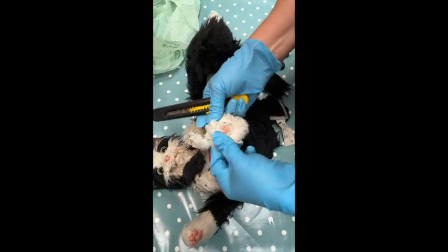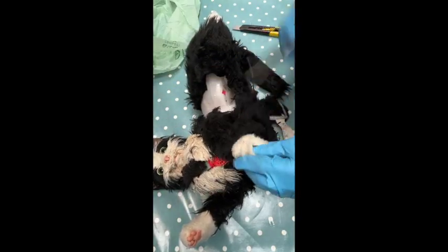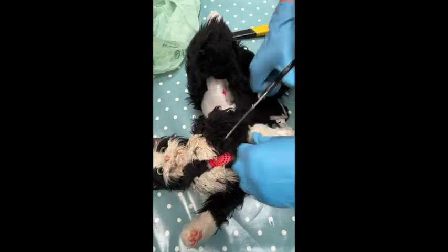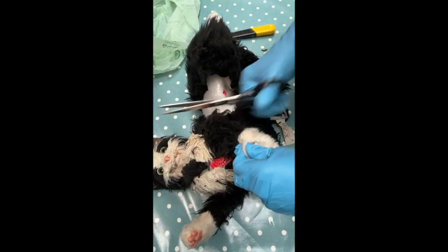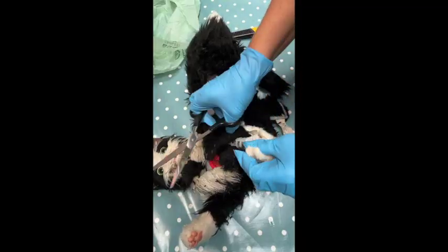Yeah, looks like fabric sewn to plastic here. That's the paw. I'll bring it through. And then... Okay, so that's the paw.